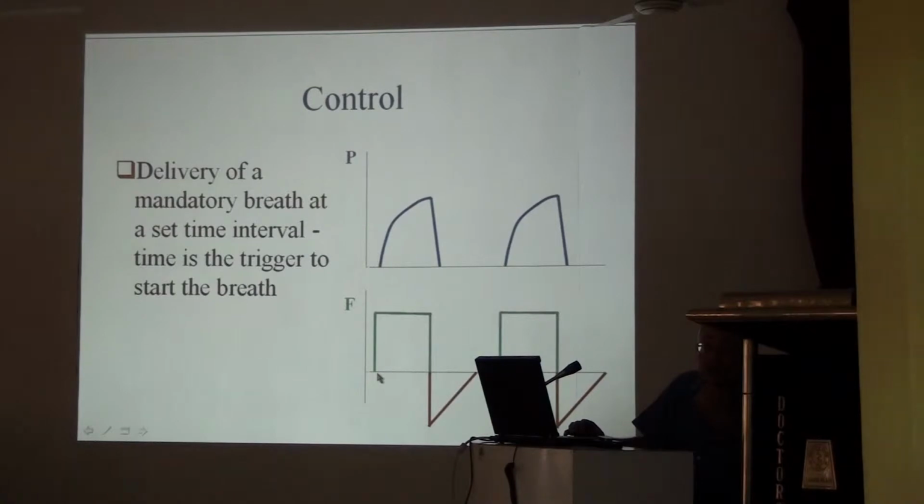This is a classical control. That means pure and simple mechanical pressure. No relation with the patient's characteristics or anything. It means what I have set, the patient will get. There are two curves, one for the pressure, one for flow.